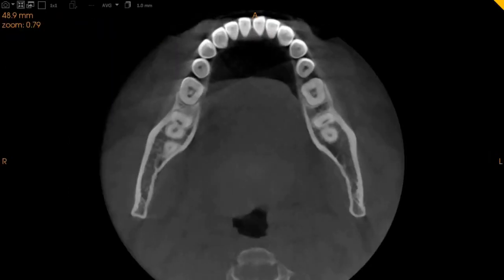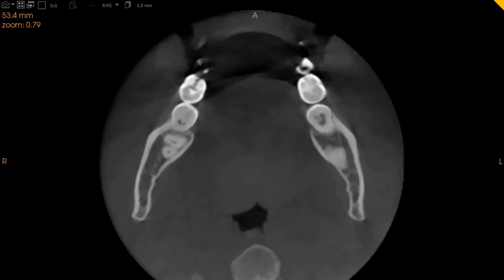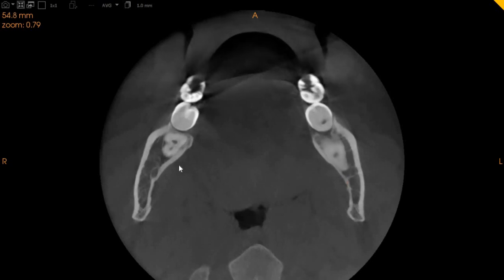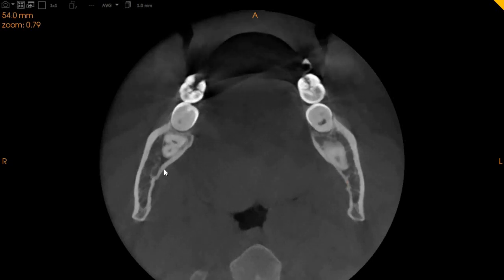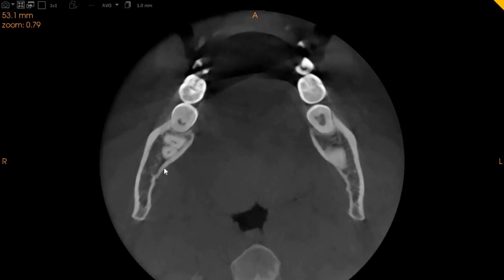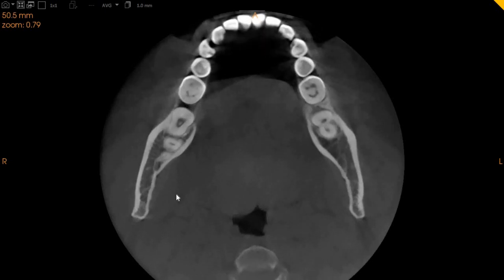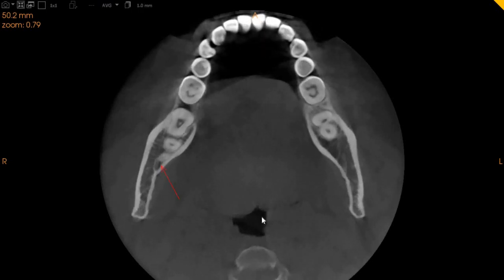This is the axial view, or the top-to-bottom view. Here also you can very clearly observe these are the wisdom teeth. This is the inferior alveolar nerve with one tooth, and as we move towards the apex, you will see the inferior alveolar nerve come close to the apex of the right side as well, which is right here. Thank you very much.